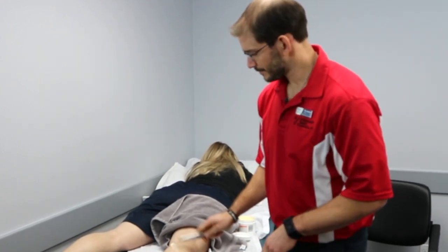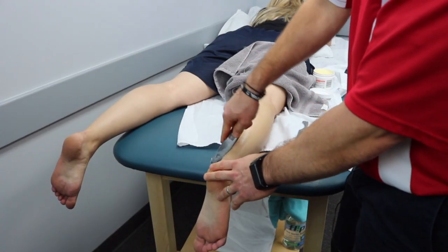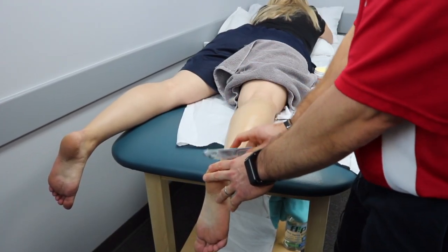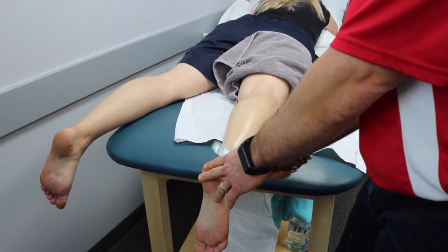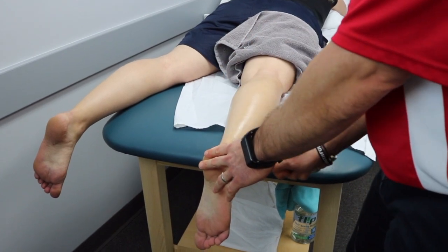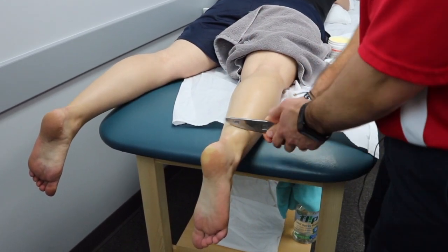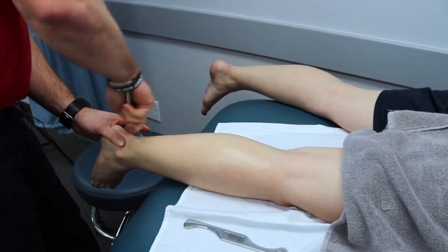The idea is that our soft tissues need to slide and glide past each other — we're just making sure there are no restrictions between those layers. Today I'm working on her calf and Achilles complex, focusing on loosening up the restrictions in the gastroc, soleus, and surrounding tissue to increase blood flow, decrease restrictions, and help improve her mobility.